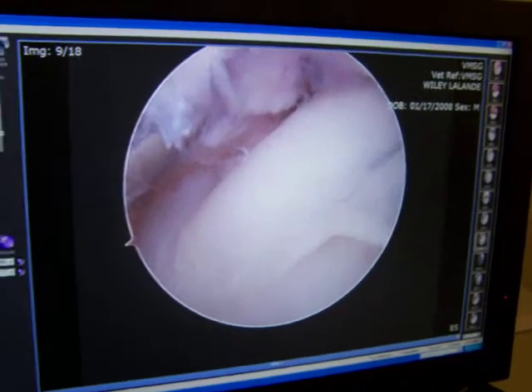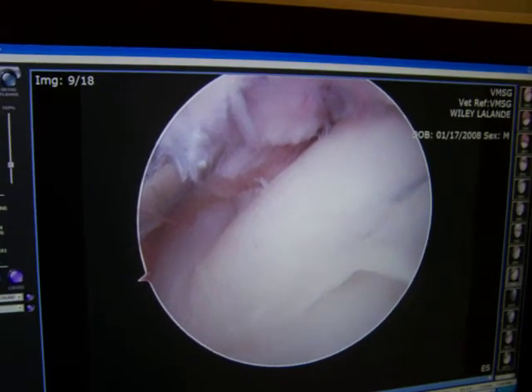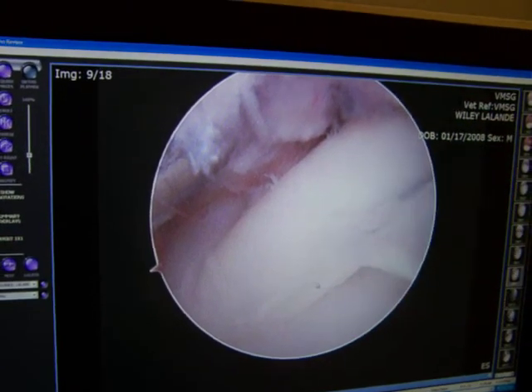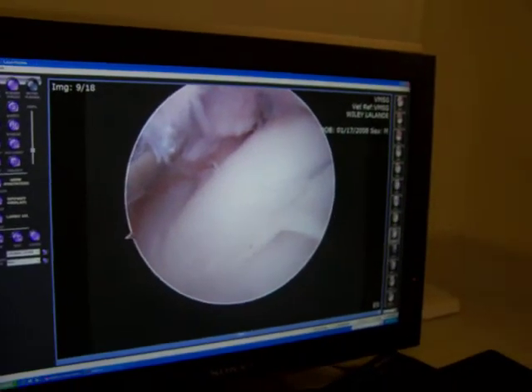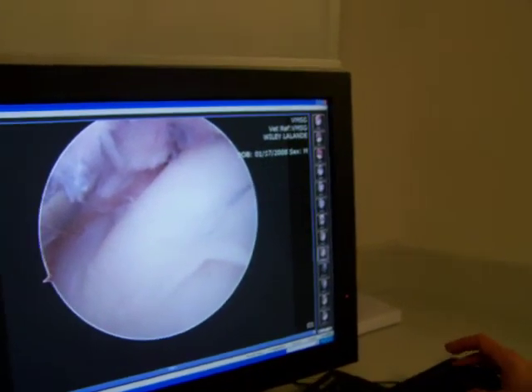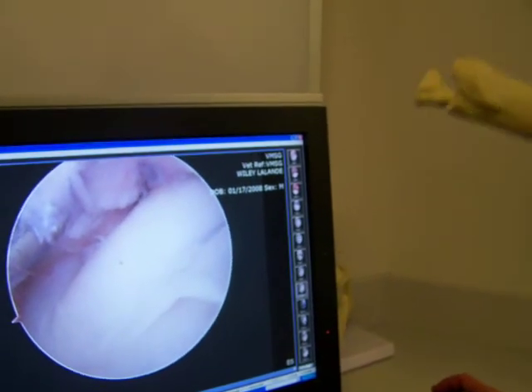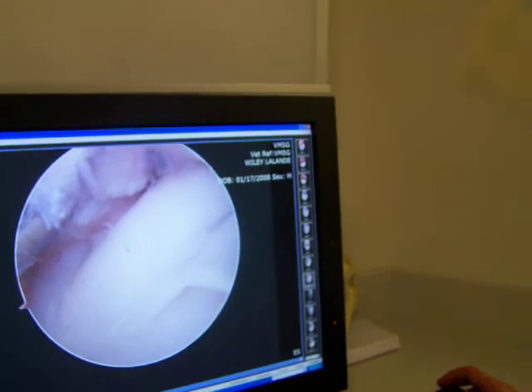We're seeing the whole base of the flap sitting there. This is the normal cartilage on the other side, so you can see this flap all bumped up and protruding. It hasn't torn free completely but it's elevated, moving, and loose — that's what causes the pain. It was actually a good thing it hadn't torn loose, good for both of us, because that's when the damage really starts.